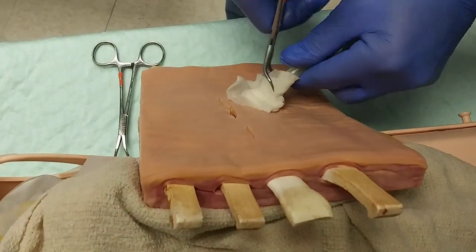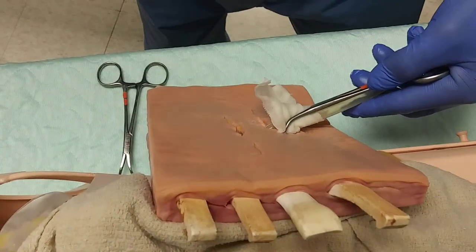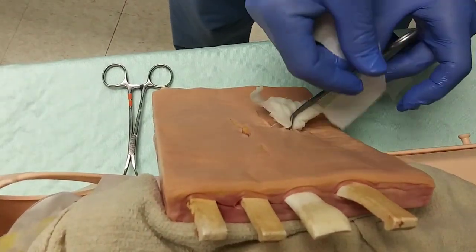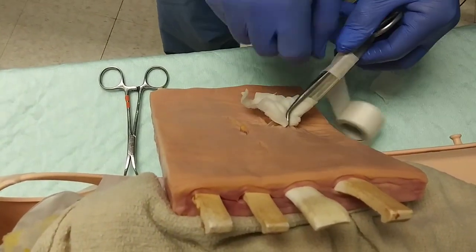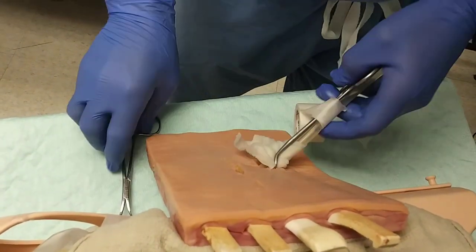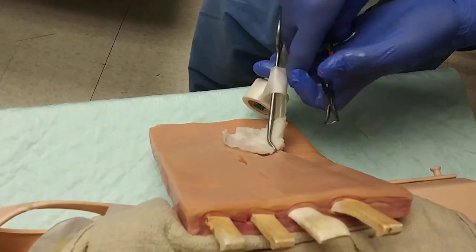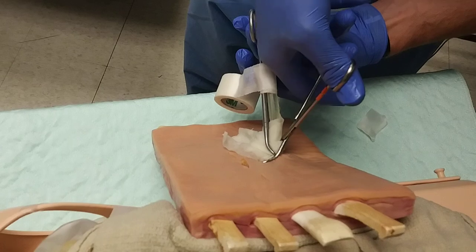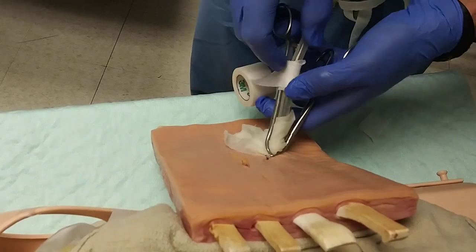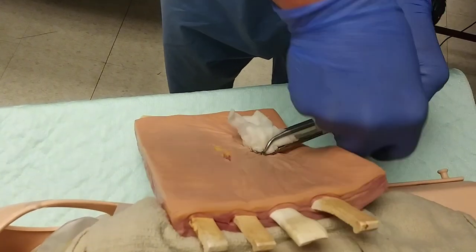We're then going to take our first towel clamp and secure that, grab our first bit of tape, and make our first loop or two around that towel clamp, following up by placing a second towel clamp on the other side of the tube that can then be taped.